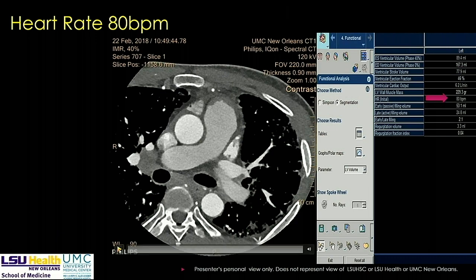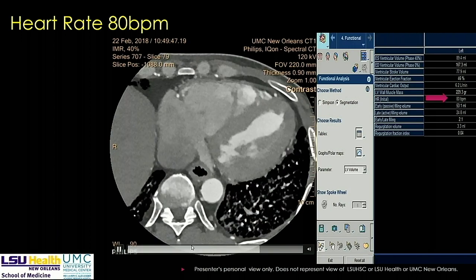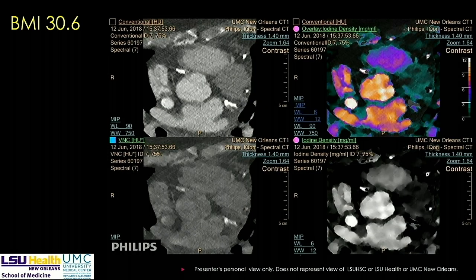The question arises: how good is this technology in challenging circumstances? One case was a diagnostic CT performed at a heart rate of 80 — the technology holds up even at higher heart rates. Another challenging patient had a BMI of 30.6. Source-based dual energy systems would be challenged to scan this patient for coronary analysis. The images look grainy given the patient's size, but can we still do material decomposition reliably at BMI 30.6? This case shows we can.